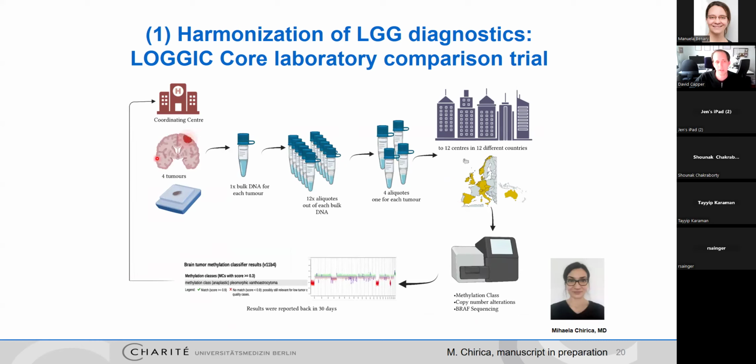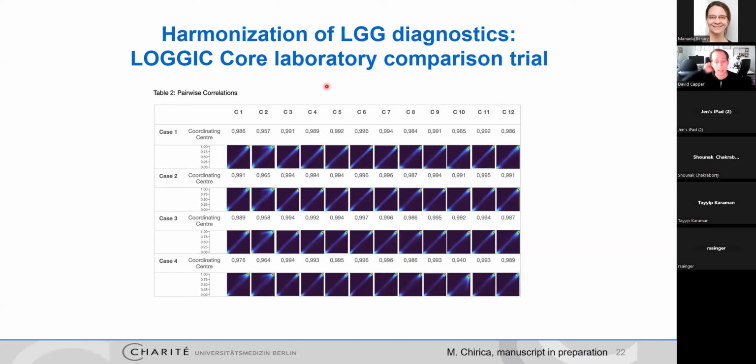So this is one example, just demonstrating how highly standardized it is to classify these tumors and how easy it is nowadays for us, if we use DNA methylation, to make a statement. For example, if I get a data set from a colleague in Madrid and he asks me, okay, what do you think of this tumor? Then if he sends me this DNA methylation data, and if the DNA methylation data is of good quality, then without any further requirement for me looking at the tissue, I will have a very good chance of making a very distinct diagnostic interpretation of this tissue.